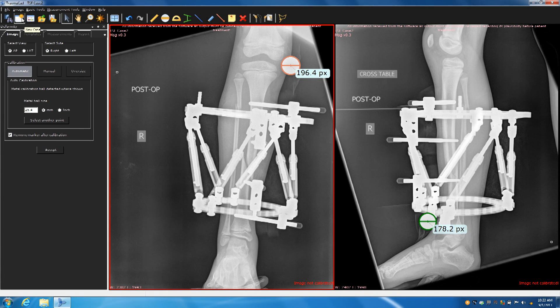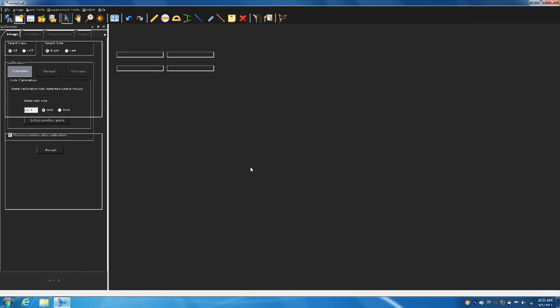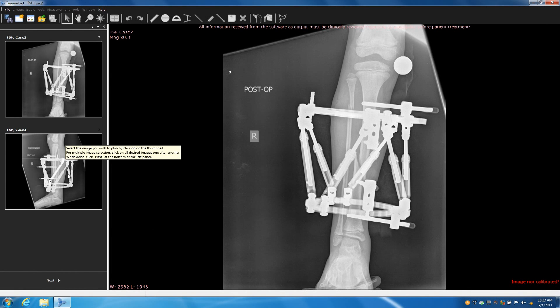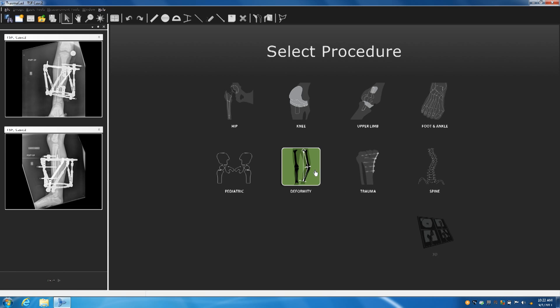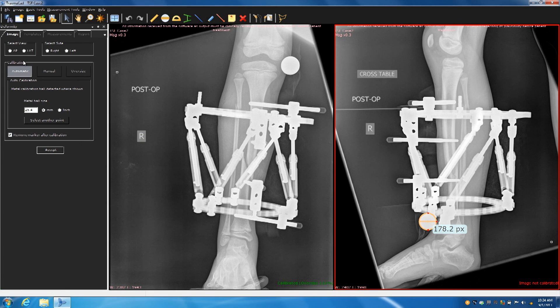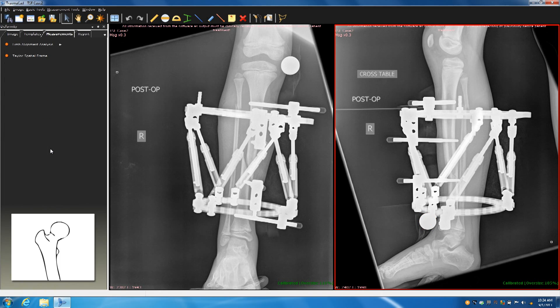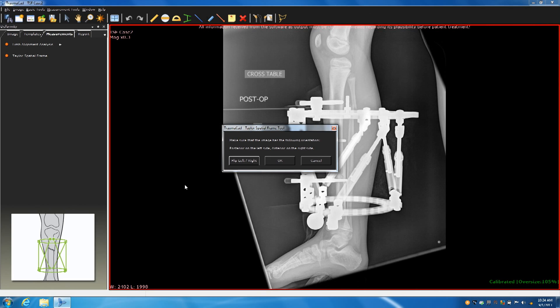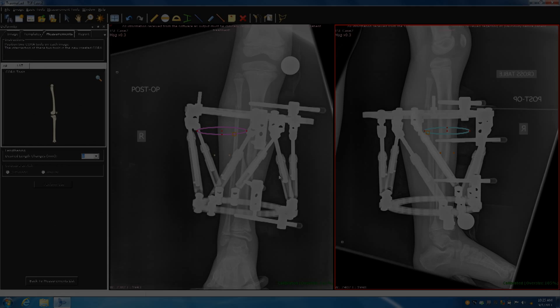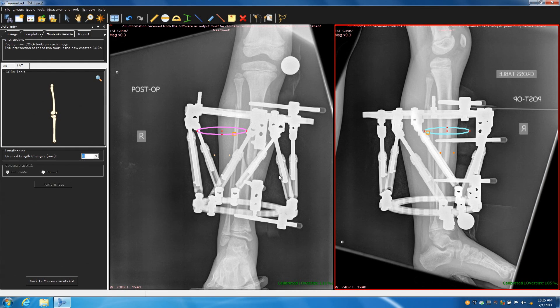Choose deformity. Let me go back and open this up again. So again, case number two TSF: you need to select both images, then hit next, then deformity — that's where the TSF lives, even though it's trauma. It's really important to know your left from right, which I'm still working on, and hit accept. Then you hit spatial frame, make sure you flip it so it's pointing anteriorly, and start aligning your rings. It'll say, are you looking to the right? You can say yes or no — that's just how it's oriented.